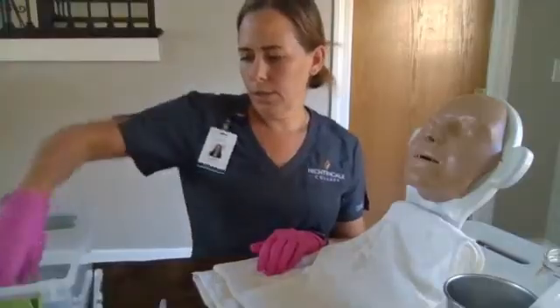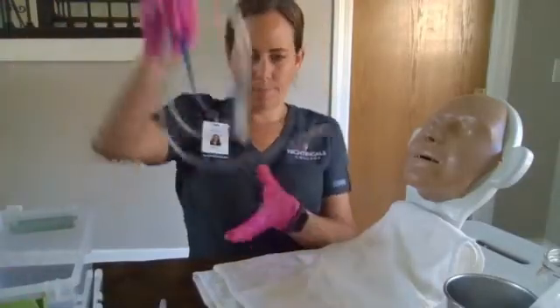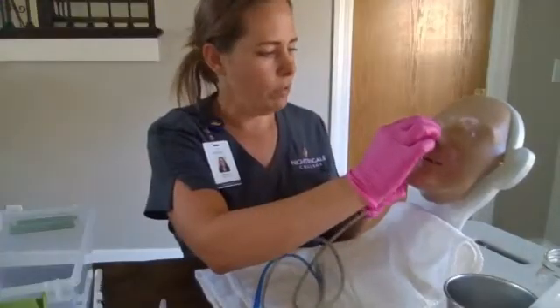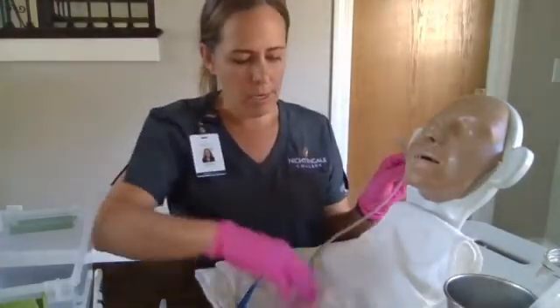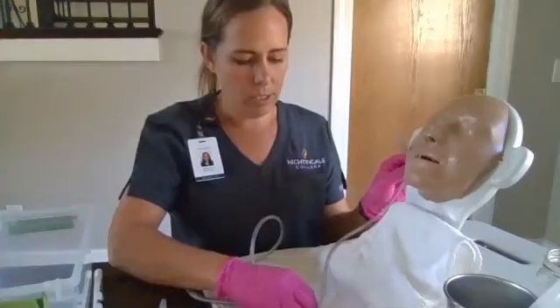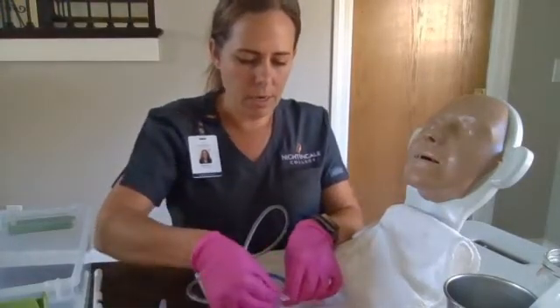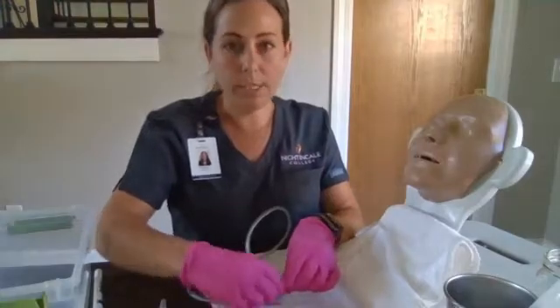We are going to get our tube and measure — measuring from the tip of the nose to the tip of the ear and down to the xiphoid process. For you, it's going to be 50 centimeters, so we will use our tape to mark that.